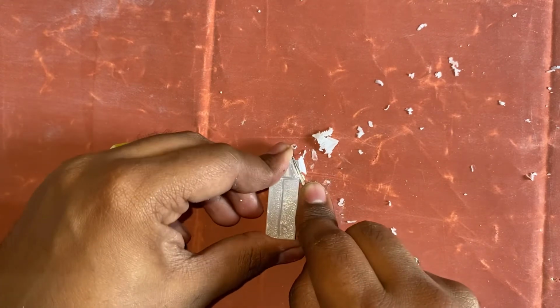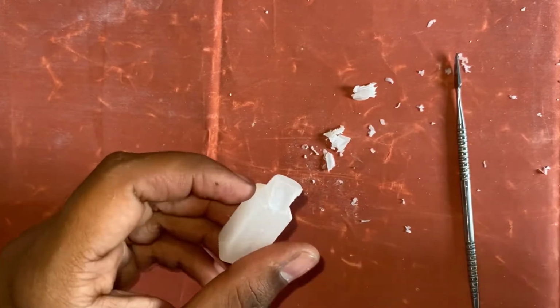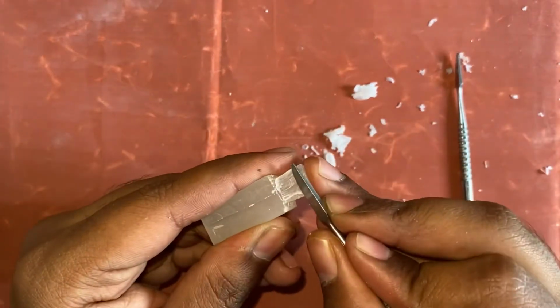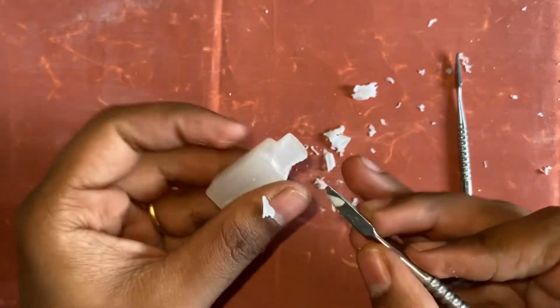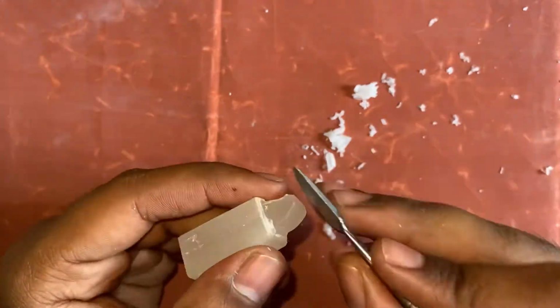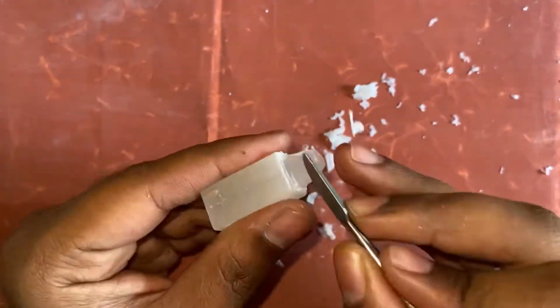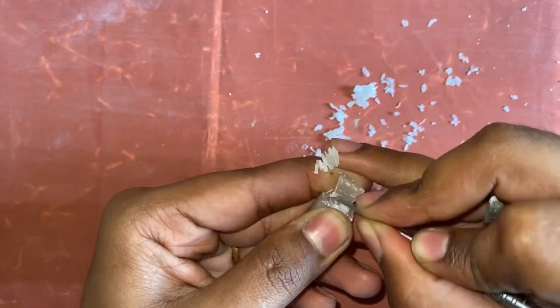More wax should be removed towards the incisal aspect than on the cervical side, so that it gives a tapering effect or a sloping surface. Correctly measure the mesiodistal dimension and then you can remove the wax accordingly to the marked dimensions.